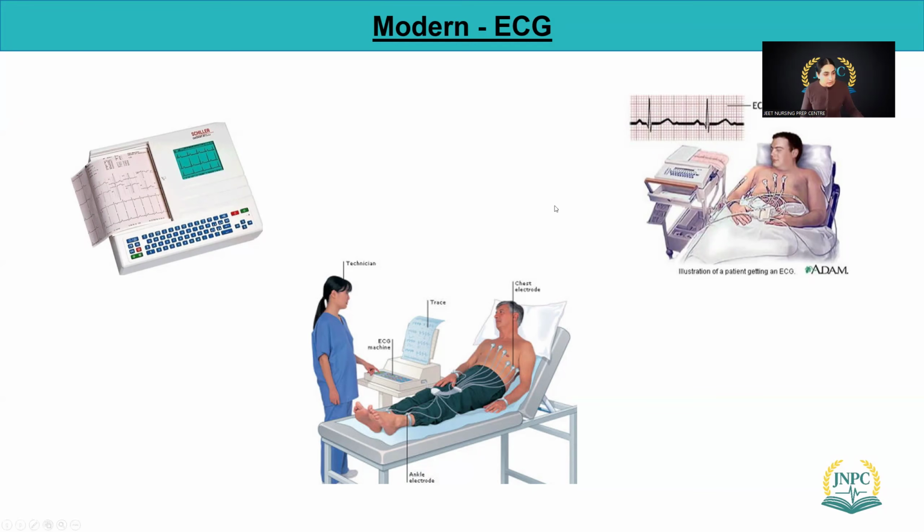Okay, so that's one thing. I'm going to show you how to put these electrodes on. We use something called a 12 lead ECG, but these leads are not exactly 12 in number. It's just your paper recording 12 views of the ECG. We do not count 12 leads, those are actually 10 leads: four for the limbs, and the remaining 6 are for your chest. I'll show you how to put those on. Those are very easy. Any questions so far?